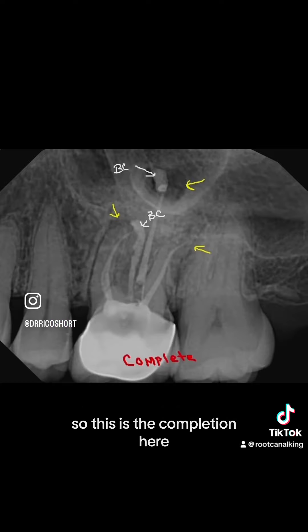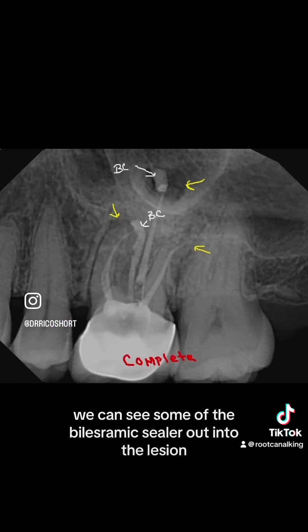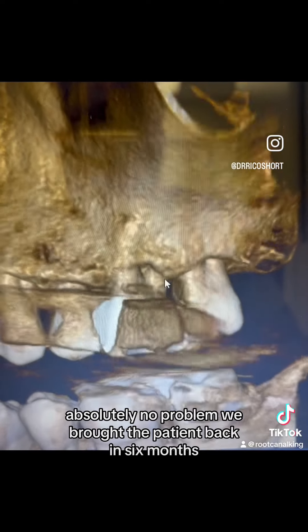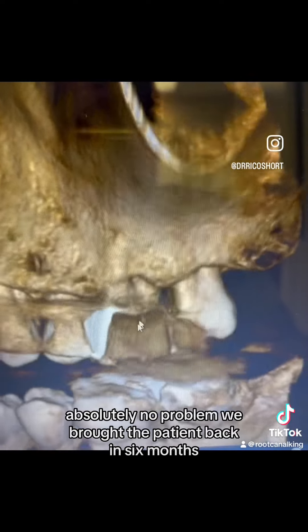This is the completion here. We can see some of the bioceramic sealer out into the lesion — absolutely no problem.